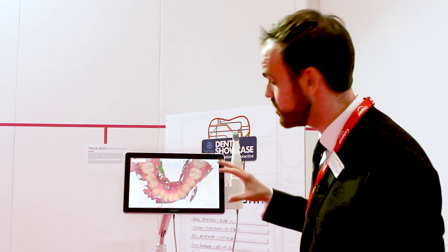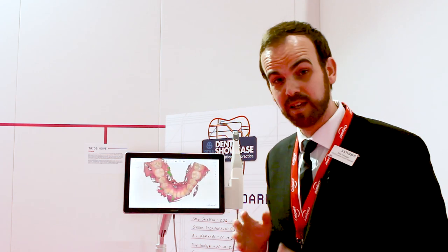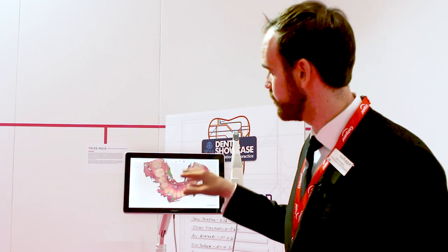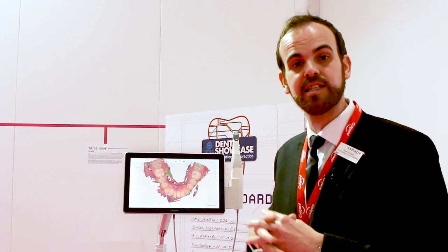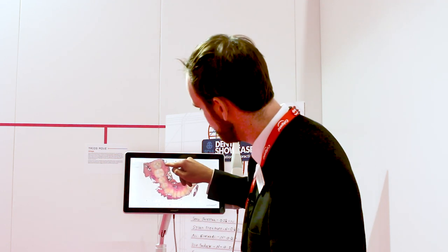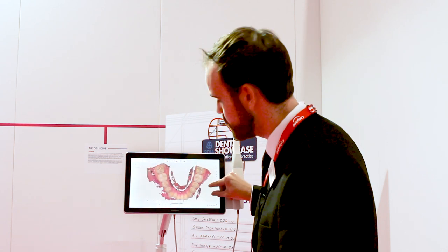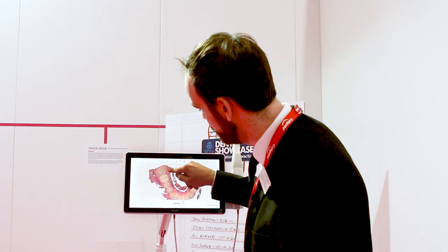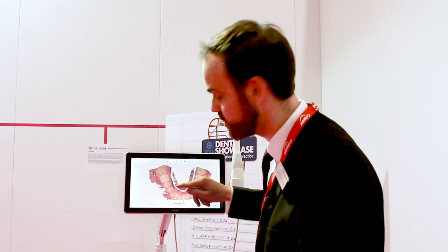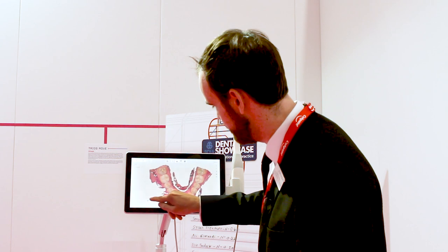Patients will naturally want to ask the dentist about their concerns and requirements. Here we have the lower scan being done. These green areas aren't the spinach I had earlier — they're areas of missing scan data which we go back and rescan. What I'm doing by trimming is removing any unwanted artifacts of soft tissue that are not needed.